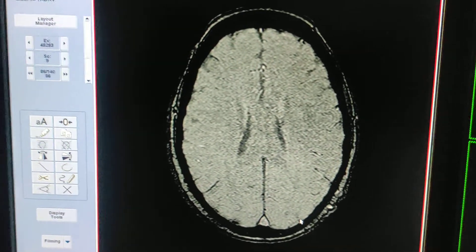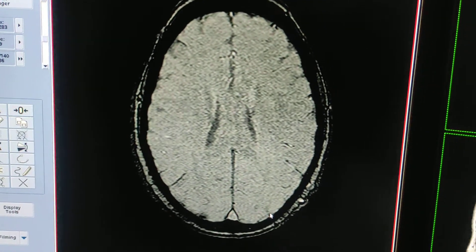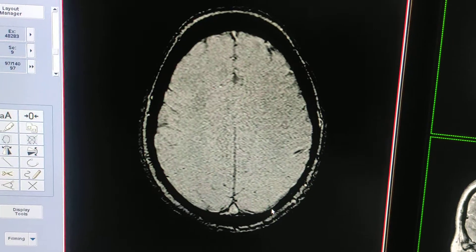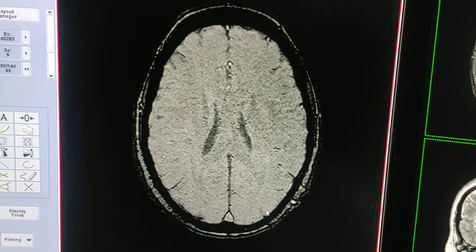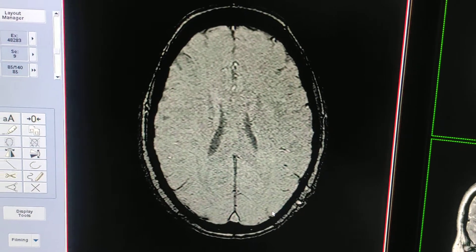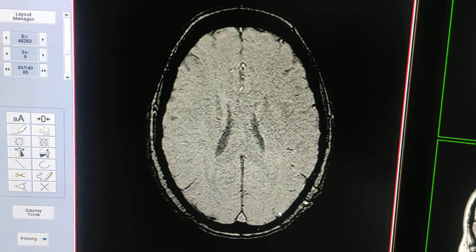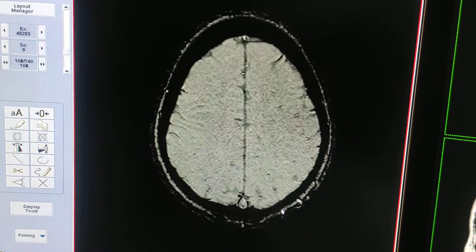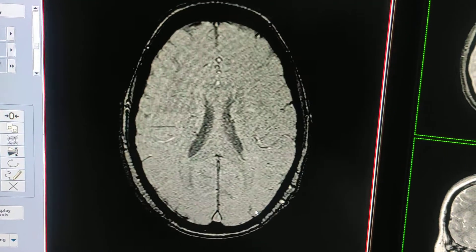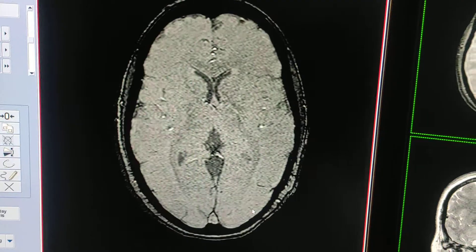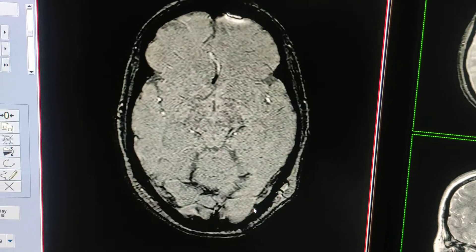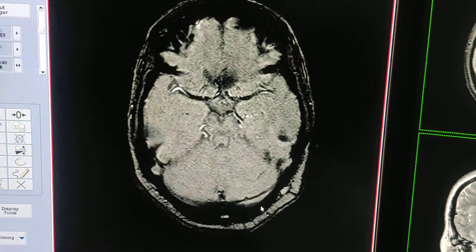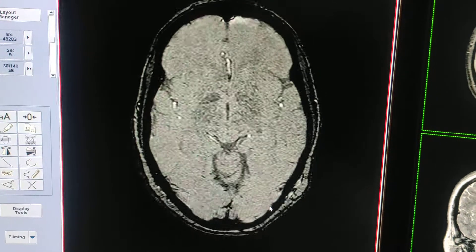SWAN is mainly used for diffuse axonal injuries for brain injuries. When there are diffuse axonal injuries, there may be tiny hemorrhages in the deep subcortical white matter which are mainly not visible on CT or conventional MRI. For that case, you should always use this SWAN sequence to rule out micro bleeds.